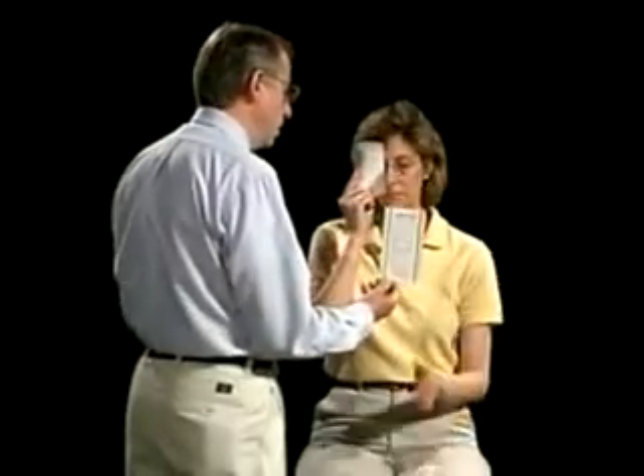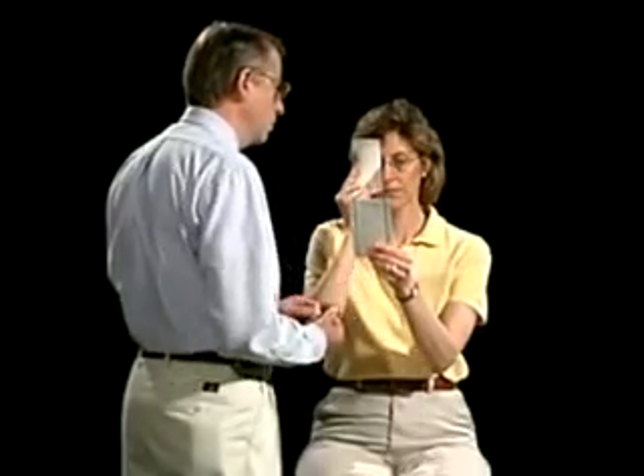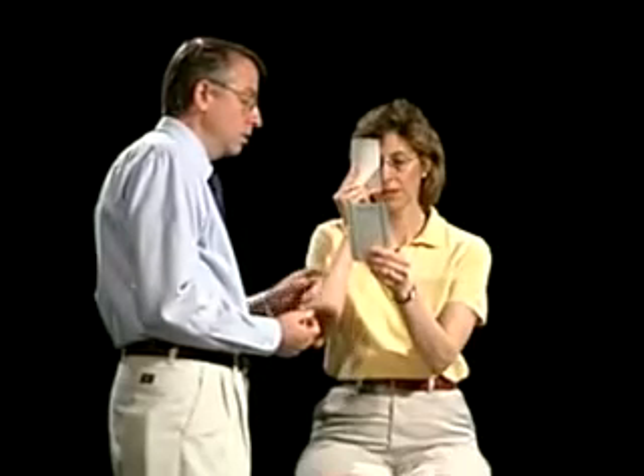During the visual acuity test, I want you to wear your reading glasses and hold this card over your right eye. We're going to use a pocket Snellen chart, and I want you to hold this in your own hand so it's comfortable — it's your length of focus for you. Read the smallest line. Which line can you read?